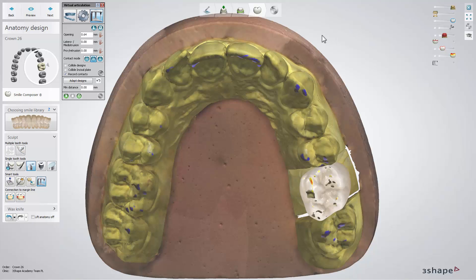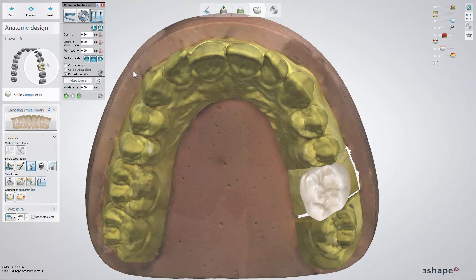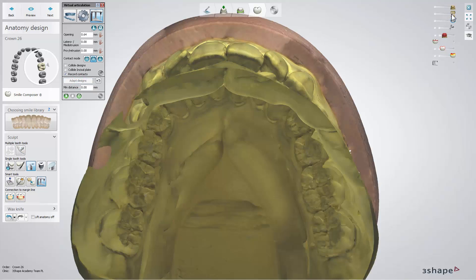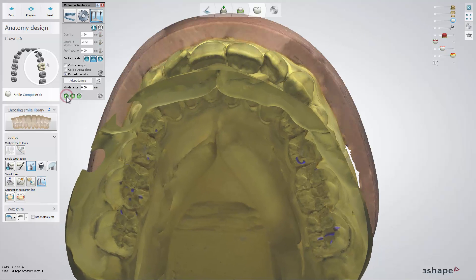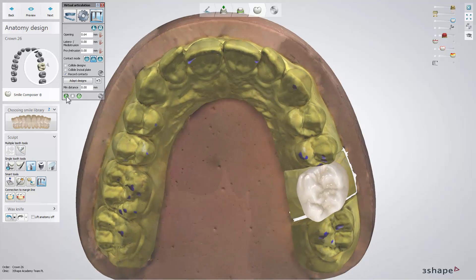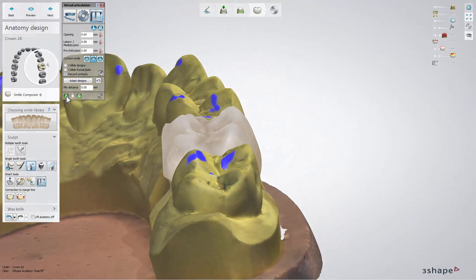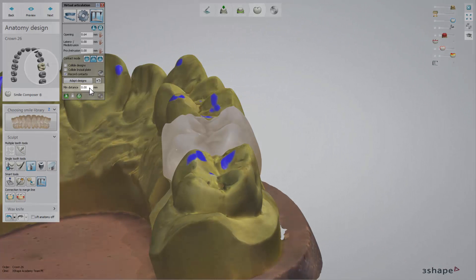Your design will be adapted to occlusion and all obstacles removed when you press Adapt Design. Furthermore, the Minimum Distance box allows you to set the desired distance to the antagonist.